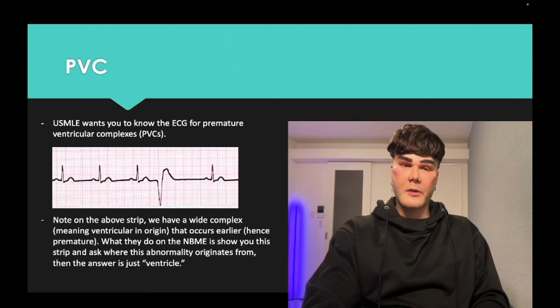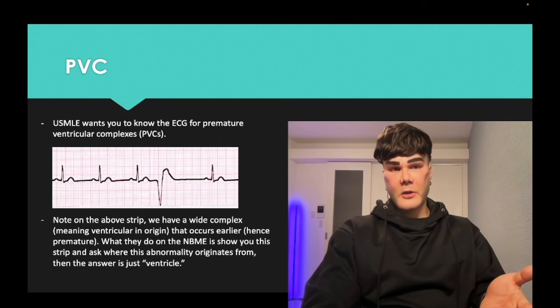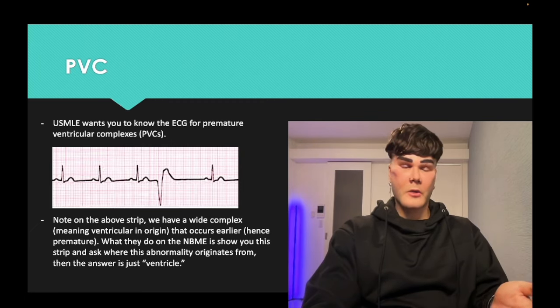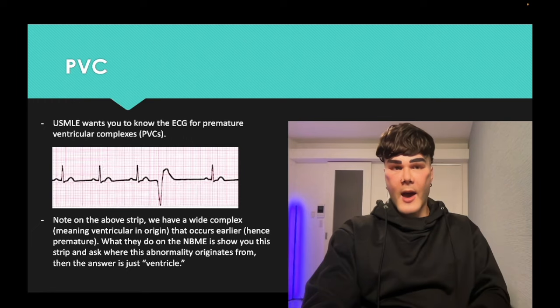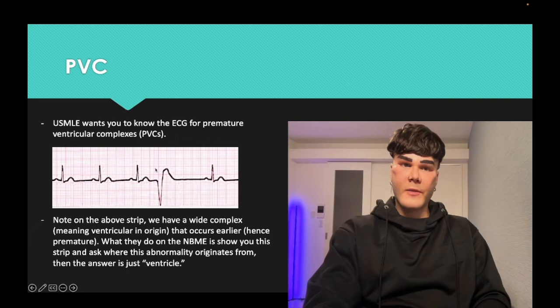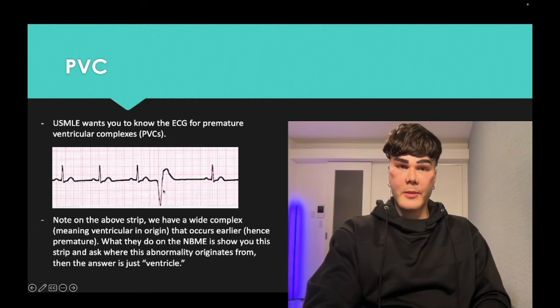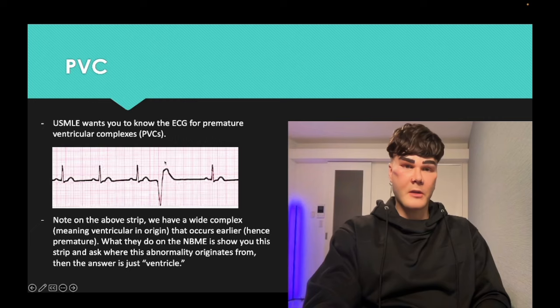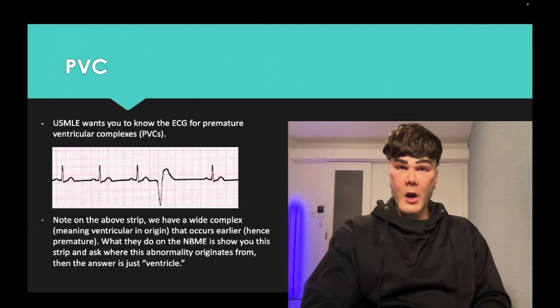Premature ventricular complexes — you need to know what these look like on ECG and just choose ventricle. You'll get this ECG on USMLE and see the abnormal part is this wide-appearing complex. Wide means ventricular. By looking at the pattern of when this complex should have occurred, it occurred a little bit early — prematurely — and it's wide. So it's a premature ventricular complex; the answer is just ventricle. You don't have to treat them for USMLE.